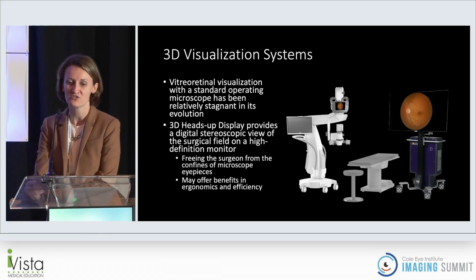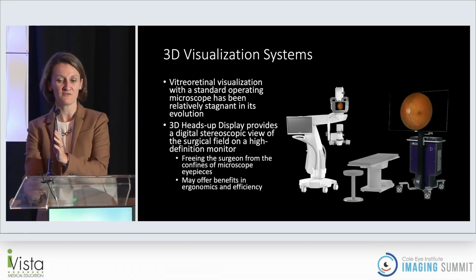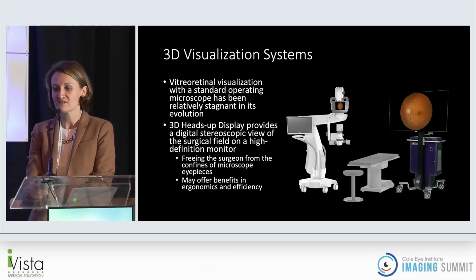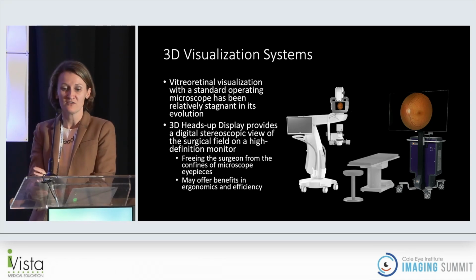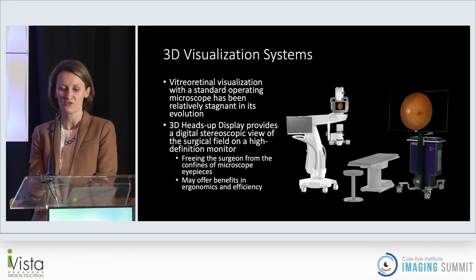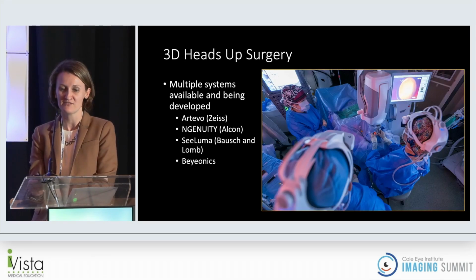So let's change gears and talk about 3D visualization systems. Operating using a standard operating microscope has really been the standard, but 3D heads-up display can offer a digital stereoscopic view of the surgical field, which can free the surgeon from having to sit at the microscope and may offer benefits in ergonomics and efficiency.